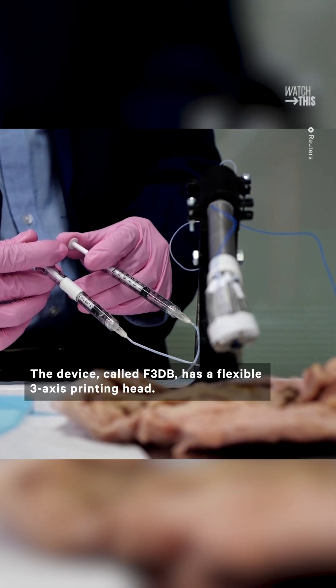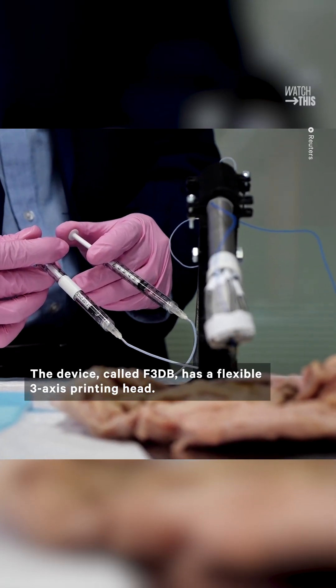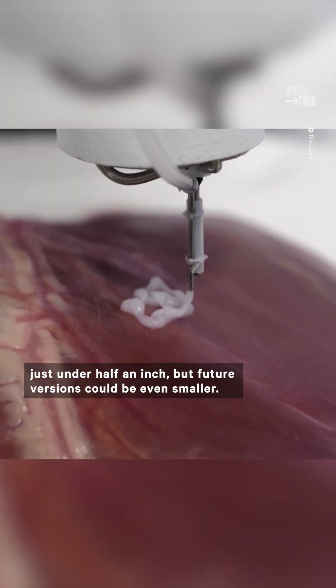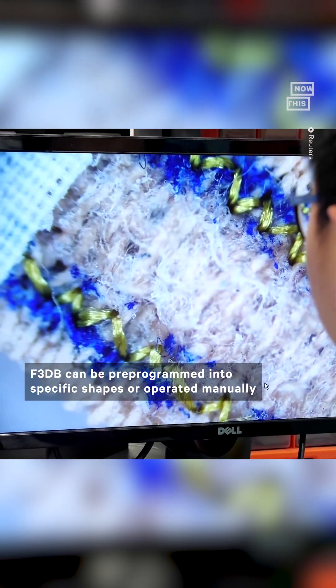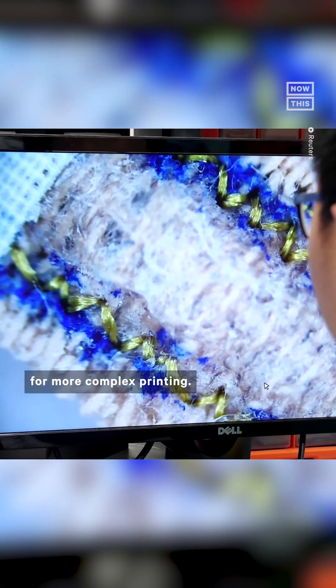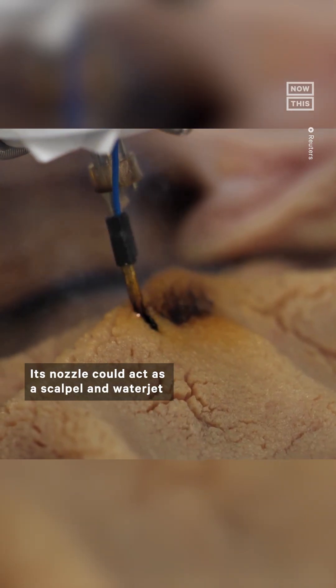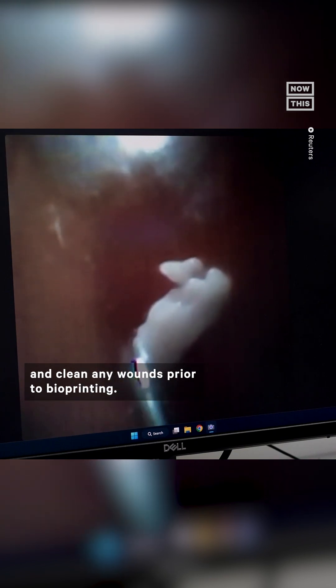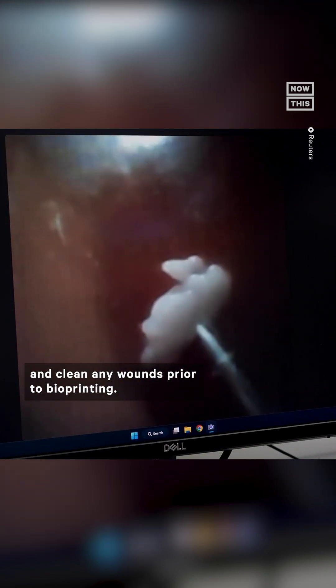The device, called F3DB, has a flexible 3-axis printing head. The smallest prototype is currently just under half an inch, but future versions could be even smaller. F3DB can be pre-programmed into specific shapes or operated manually for more complex printing. Its nozzle could act as a scalpel and water jet, allowing doctors to dissect tissue, remove cancerous tumors, and clean wounds prior to bioprinting.